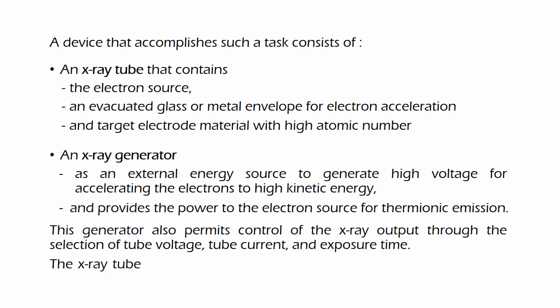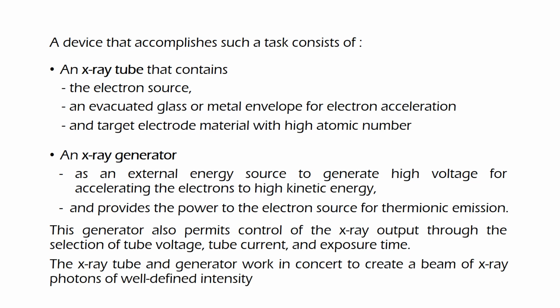The X-ray tube and generator work in concert to create a beam of X-ray photons of well-defined intensity, penetrability, and spatial distribution. Let us now study a simplified diagram of an X-ray tube and briefly know its components and their role in generating X-rays.